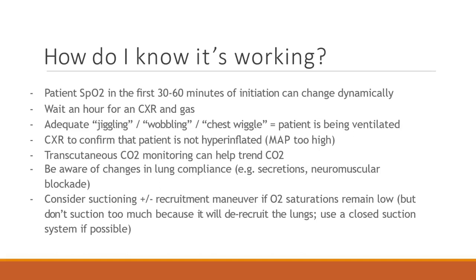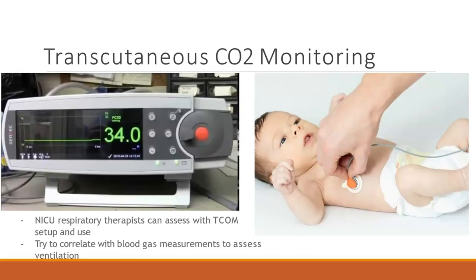Okay. Always closed suction. Always two-person cares. The nurse shouldn't even be changing a diaper without the respiratory therapist at the bedside, because anything can happen. We really want to not let that patient become off the oscillator for any reason.